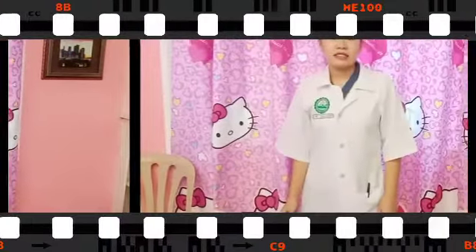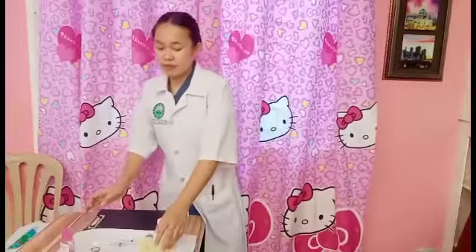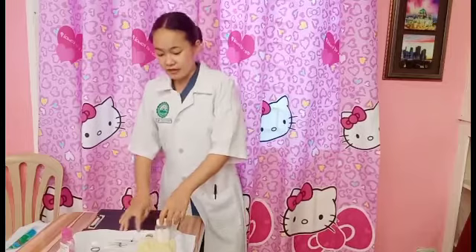Next is to follow the 3 checks of drug administration. First is when it's taken from the medication cart. Second is before withdrawing the medication. And lastly is after withdrawing the medication. Next is to confirm that the dose is correct. This is to avoid medication error. Next is to organize equipment because organizing equipment will provide a smooth procedure and easy access to the materials or equipment needed.